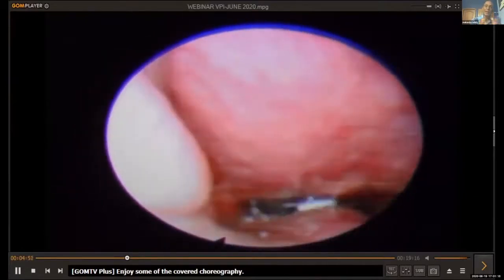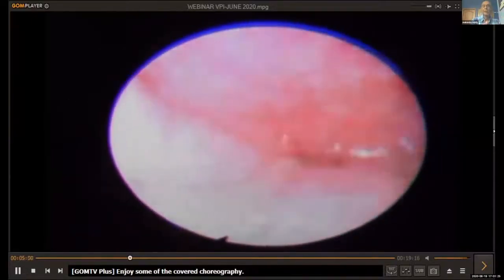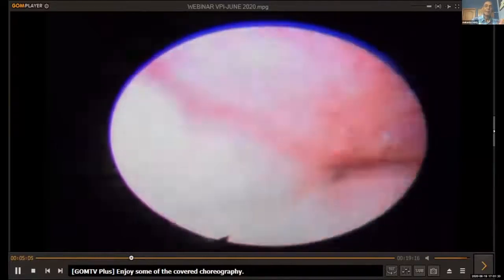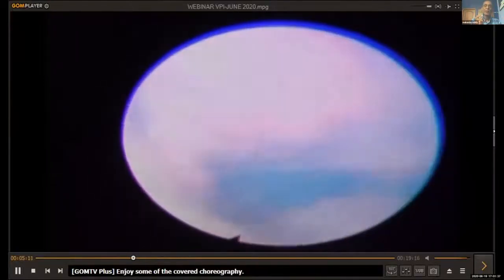The child or the little older individual you are doing, the youngest we have done is around 5 years, like Savita has mentioned earlier. As they grow older, it becomes easier. So when you use a template and use the same words as a repetition when you do the endoscope, it becomes easier because the patient knows what to expect.